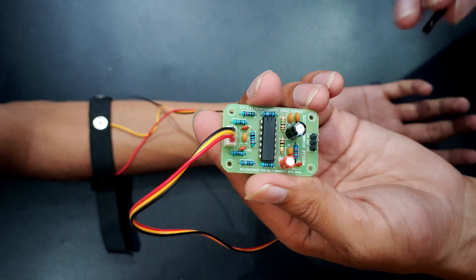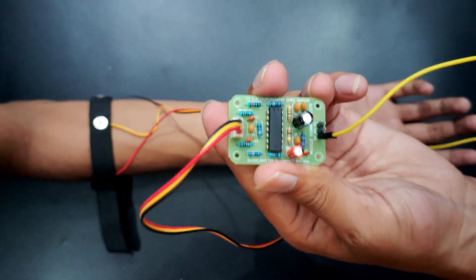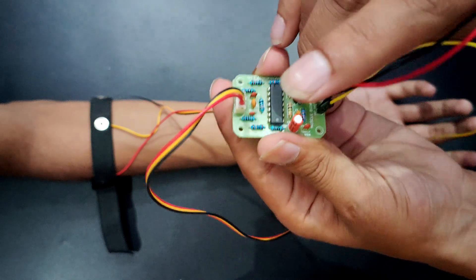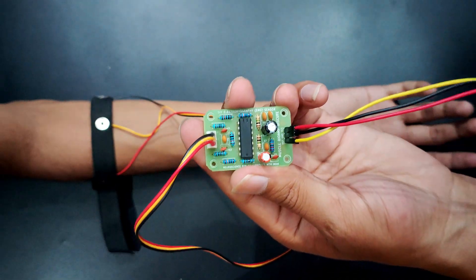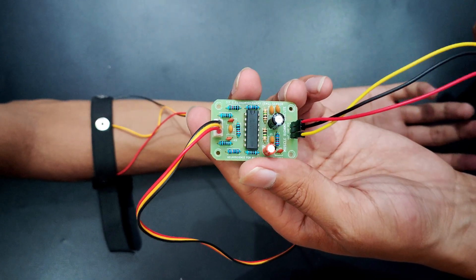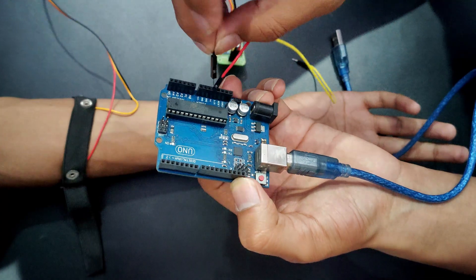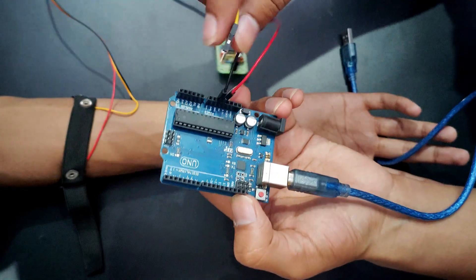Now use the jumper cables. Yellow one on OUT, then black, and then on VCC use the red one. Now we will connect these jumper cables directly to our Arduino Uno. We can use any other development board also. Now put the red one on 5 volts, black one on ground, and yellow on A0.